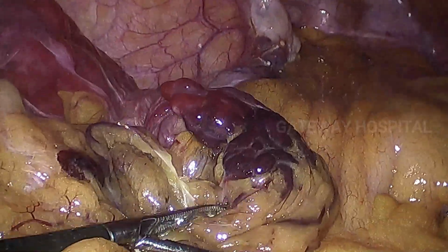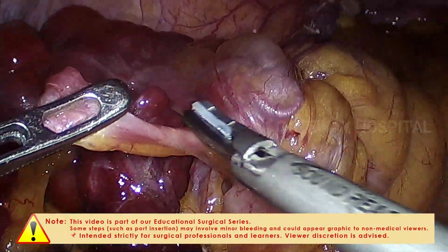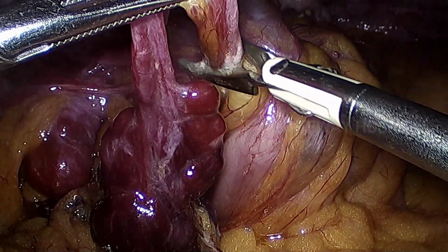Hello everyone, I am going to show an interesting case. This patient presented with a large abdominal mass, and after evaluation we are posting this patient for laparoscopic surgery.